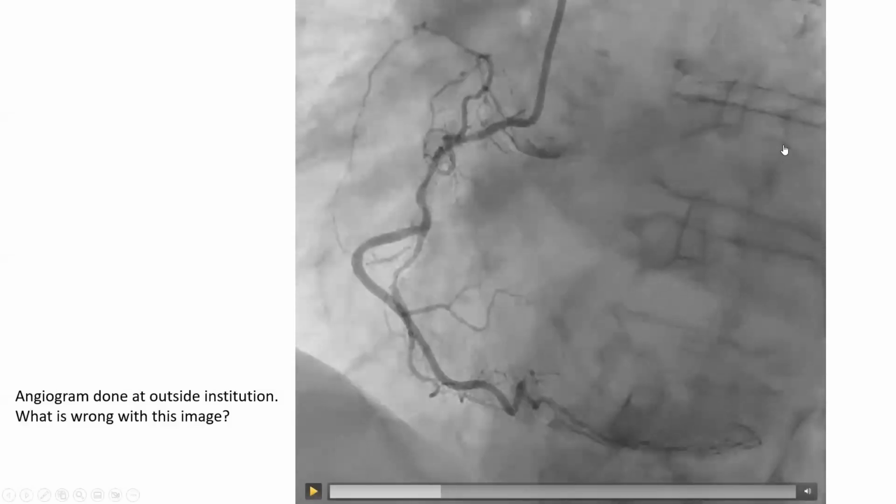Okay, and you're having damping or ventricularization on your hemodynamics. And this is what happens when you inject with a catheter that is occlusive. The contrast will stain inside the vessel. It will hang inside the vessel. Then eventually it will stain inside the myocardium. This contrast is not clearing. It will sit around in the vessel. It will sit around in the myocardium. It will not get cleared by blood.